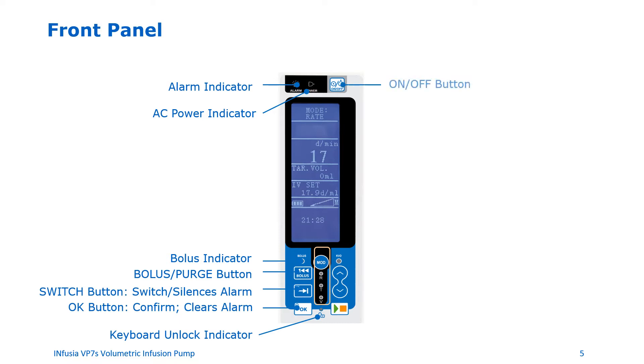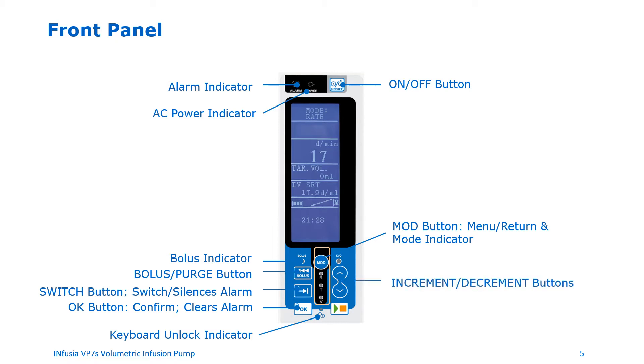On the top right there is an on/off button. The MOD button is used to recall the menu on the screen, as a return button, and to confirm the mode. The increment/decrement buttons are used to navigate the menu by moving up and down the screen. The start/pause button is used to start the pump from a standstill position and also to pause the running pump.